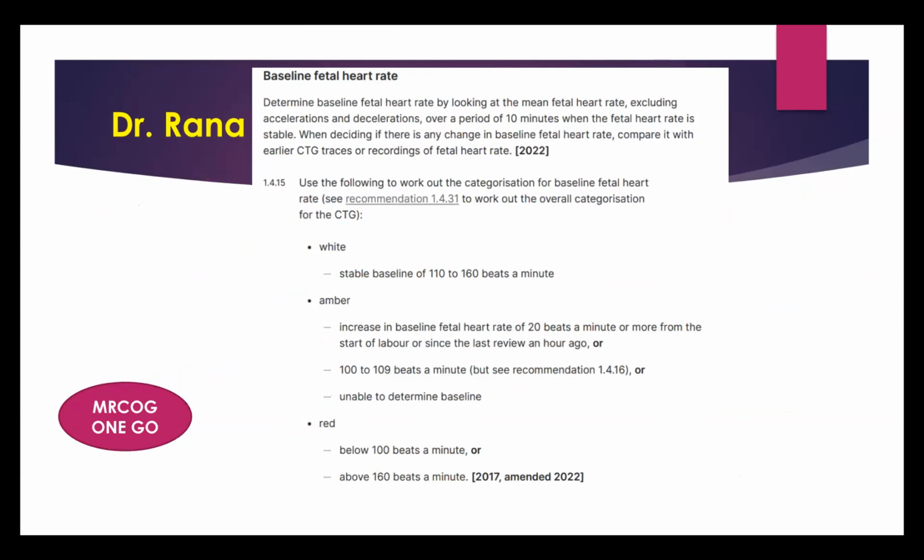Now we can classify the fetal heart rate. White, nothing to worry about. Amber, we have some concern. Red, now we have a major problem or a big concern, and we need to take action and implement some changes for this woman and then check her again.